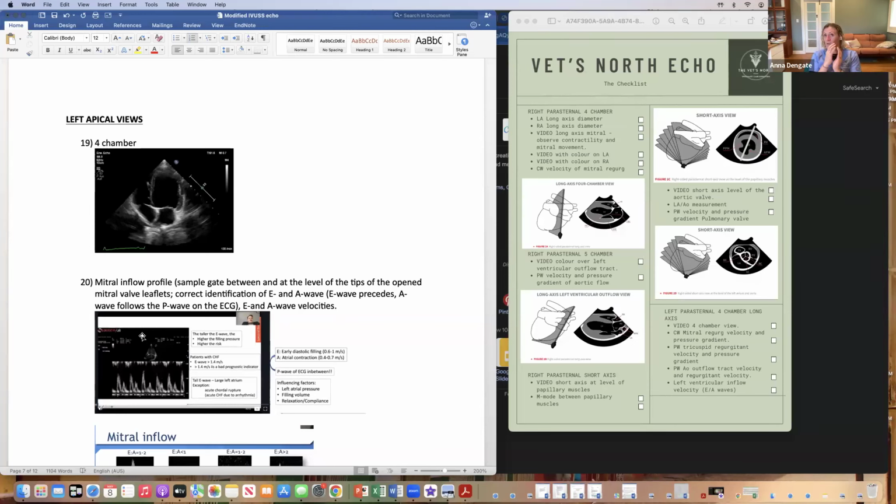Likewise, inversely, if we've got a bigger pressure differential, so negative pressure in the ventricle and a pressure overloaded left atrium, that is going to cause more flow at higher velocity from atria to ventricle. Make sense? The A wave is not as important in dogs, but we use the E/A ratio in cats to help us understand how their myocardium is relaxing.